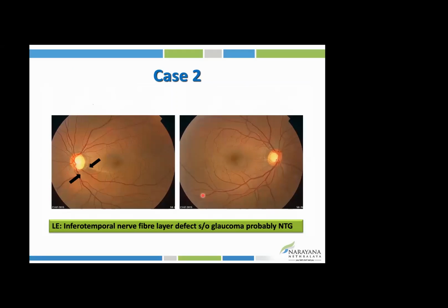So I want to end by saying that when you have a visual field, whenever you suspect the patient is not able to see, do a visual field. If you have a visual field, keep it appropriately. Use these 6 questions to reach a diagnosis. But remember, the reliability and the parameters of the visual field should be normal. The patient should be able to really have done a good test, look at the grayscale, and very, very important, never forget to clinically correlate either with your fundus findings or with your neurological test. Thank you.